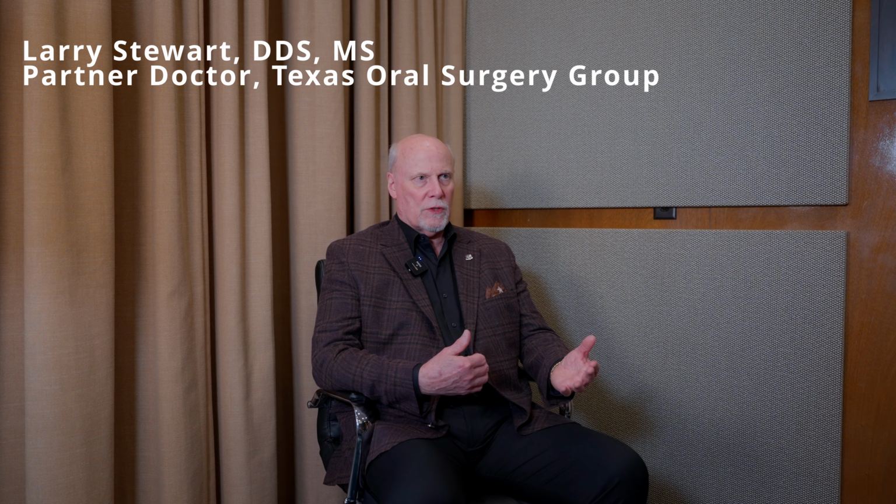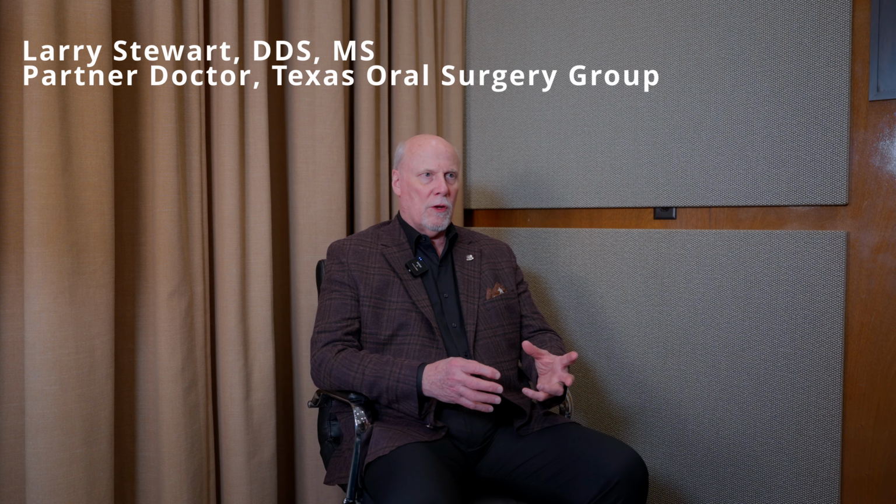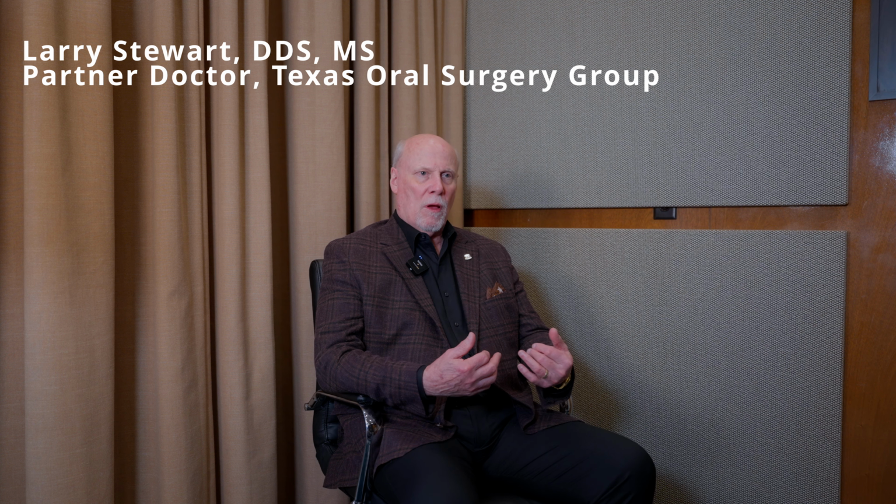Sometimes the general dentist will do the scans himself. Then we do a smile design where I may or may not be involved, but certainly the dentist is involved with that, along with the patient collaboration. So the patient gets to see a mock-up of what they can look like with this procedure. All that information is then stored on the lab computer.